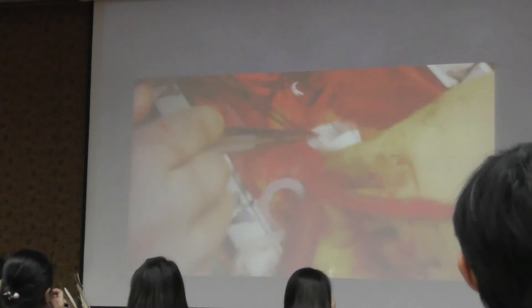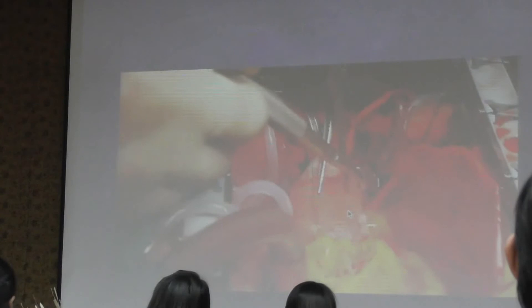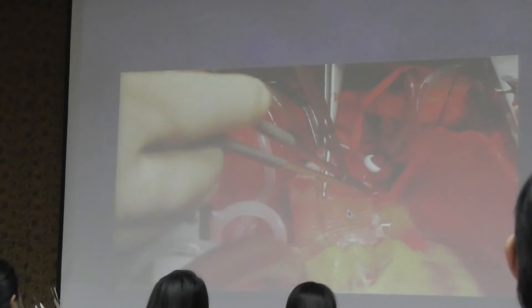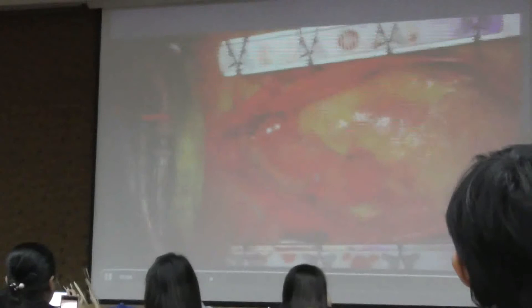After we fix the neo-aorta, the leaflets and the coronary artery, we use the distal anastomosis graft to the aorta and do a graft-to-graft anastomosis. Most of the cases need two grafts to connect. Because if we use the root replacement graft alone, it can get a little difficult to replace the wall. The result still has some mild dilatation. This is the final result — we have a plan to make the root with a Dacron graft aorta.